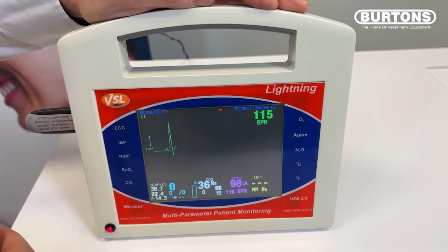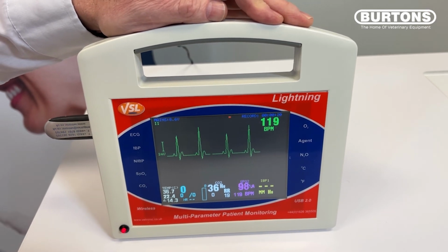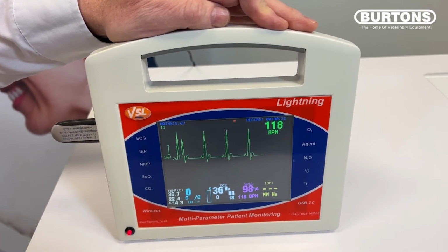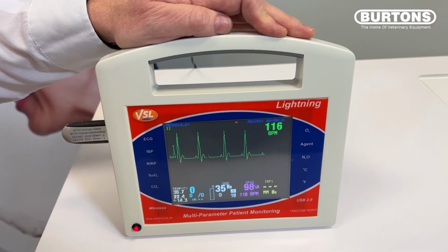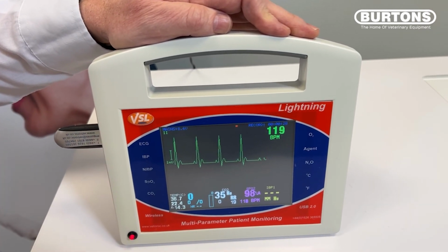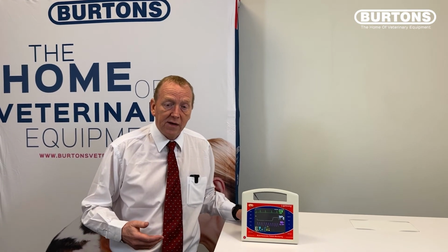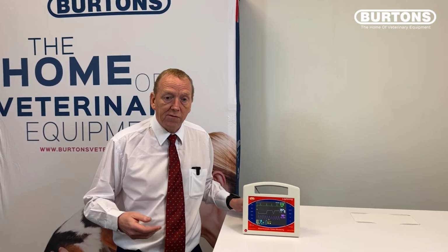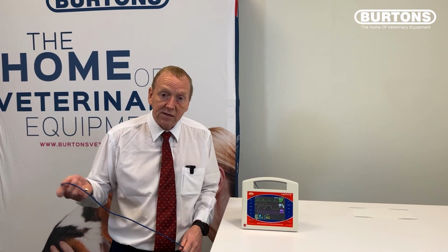And just to make a note that the ECG modules that are fitted to the Lightnings are always diagnostic quality. They are used for monitoring purposes, but their intent is to be diagnostic quality so that a full ECG workup can be done using a Lightning monitor. As I previously mentioned, we can connect the data on this Lightning monitor to a PC or laptop and then thereby expand that into a larger screen or store the data for later analysis and review.